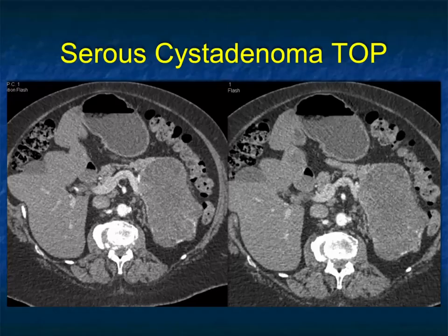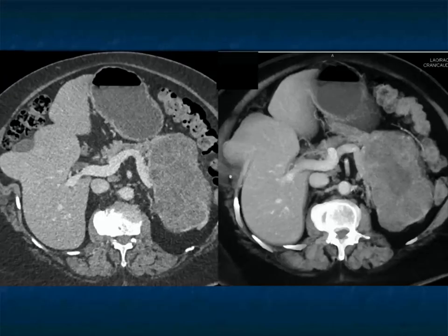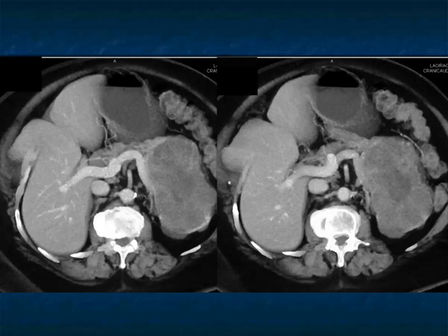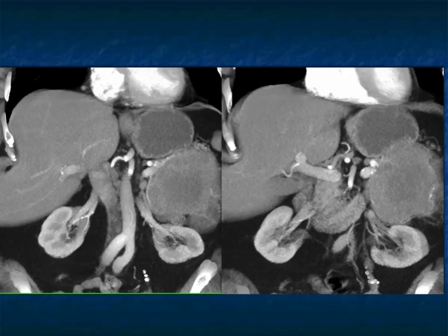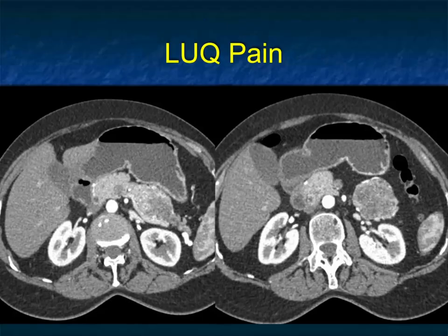Another example: a large cystic lesion in the tail of the pancreas that really enlarges the tail. As you look through the images there are lots of septations - small ones and big ones. You ask yourself what else could this be? It's not a neuroendocrine tumor - there's no vascularity. It's not the look of an MCN. It's not a lymphoepithelial cyst, not an adenocarcinoma, not a metastasis. This is a little atypical but a really nice example of a very large serous cystadenoma.